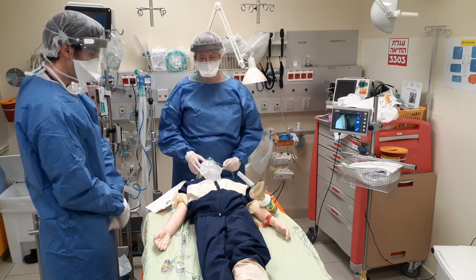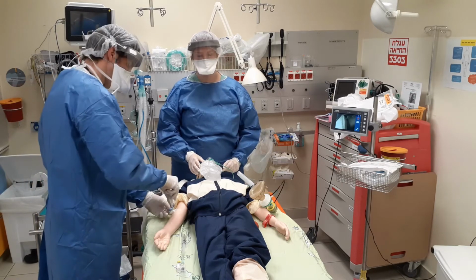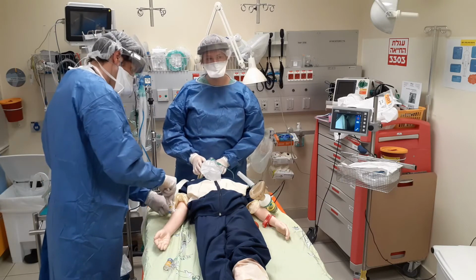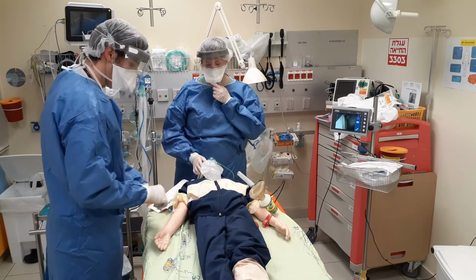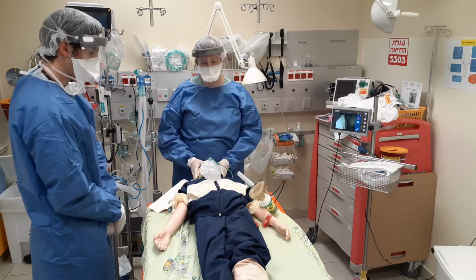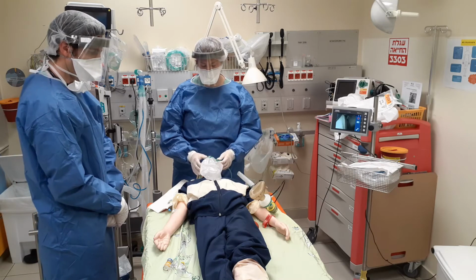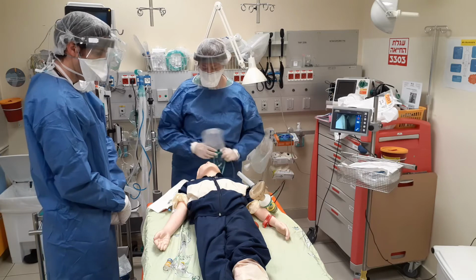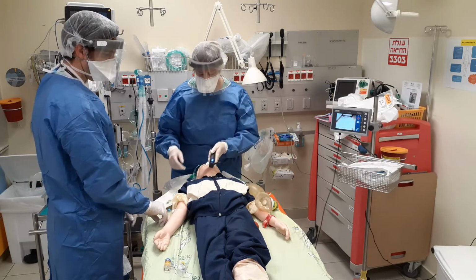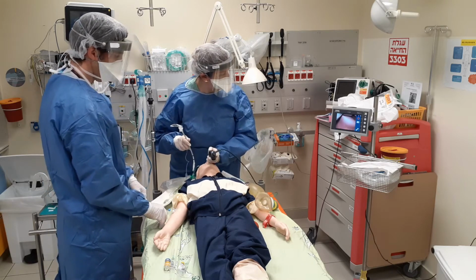Once the patient has been pre-oxygenated for 3 to 5 minutes, we may begin the rapid sequence induction. It should take 30 to 60 seconds for the medication to take effect and make the patient fully unconscious. Once this has been achieved, we may begin the intubation process using the video laryngoscope as previously stated. The reason we use a video laryngoscope is in order to keep our face as far away from the patient's mouth as possible, thus reducing the chance of infection.